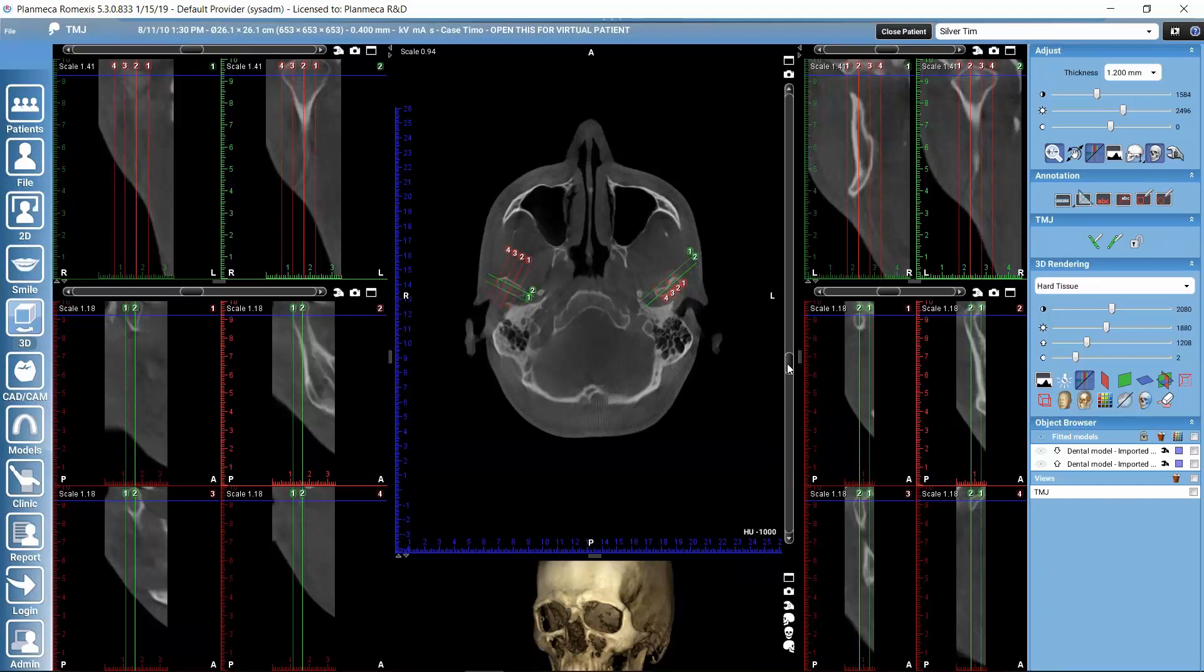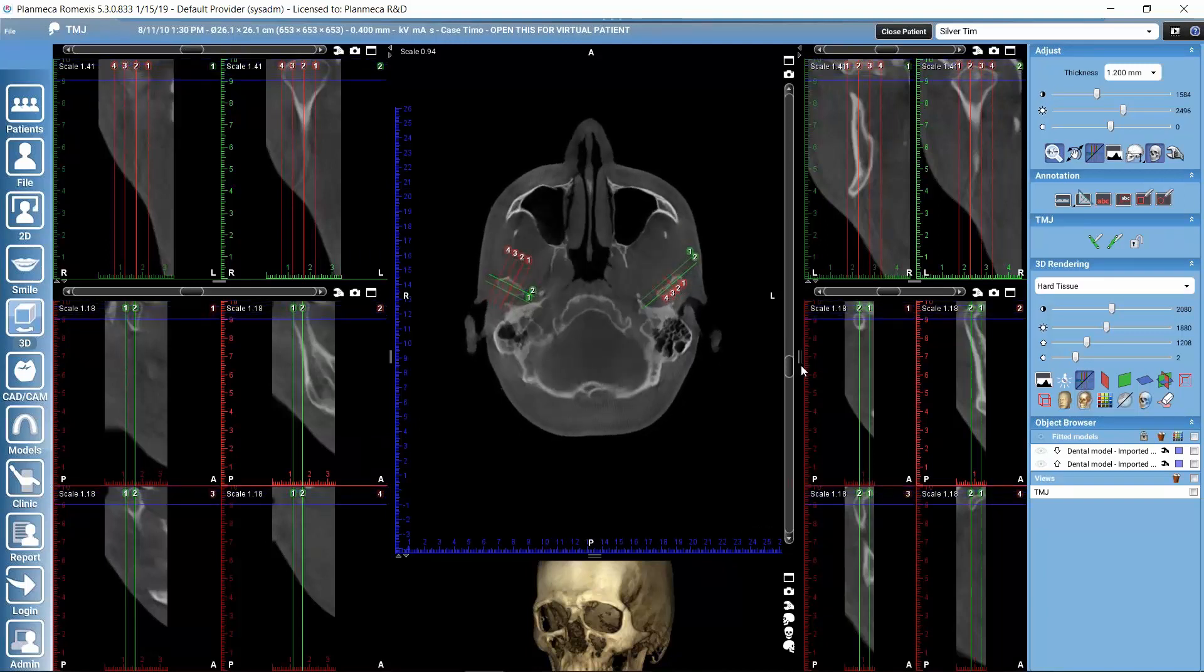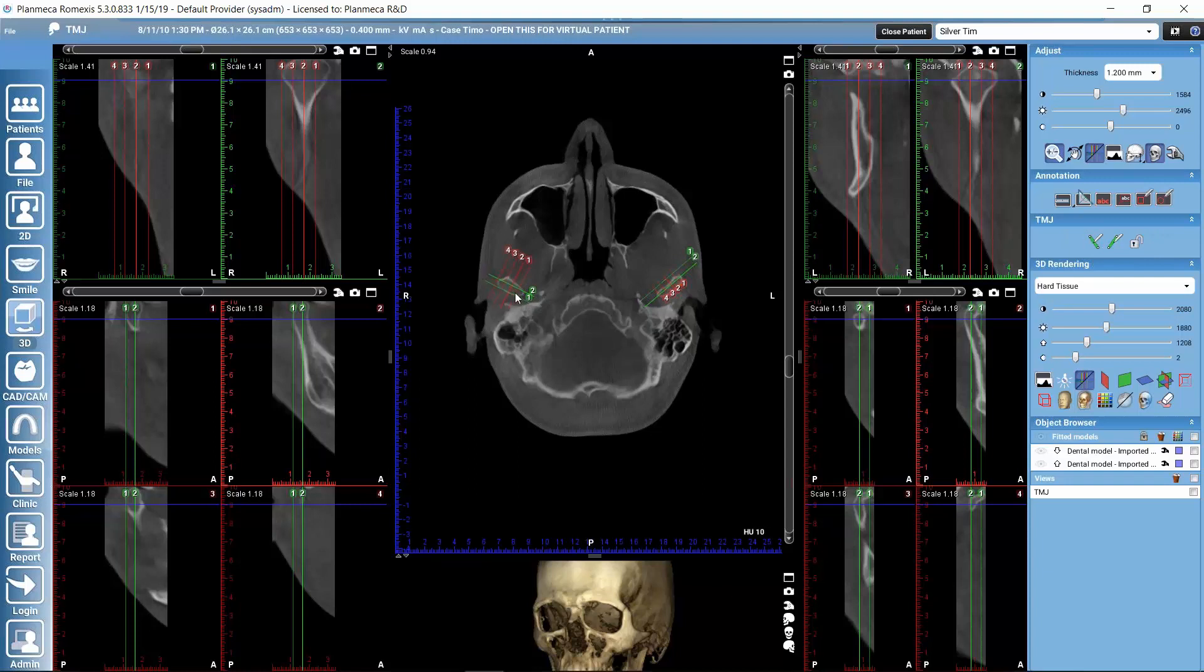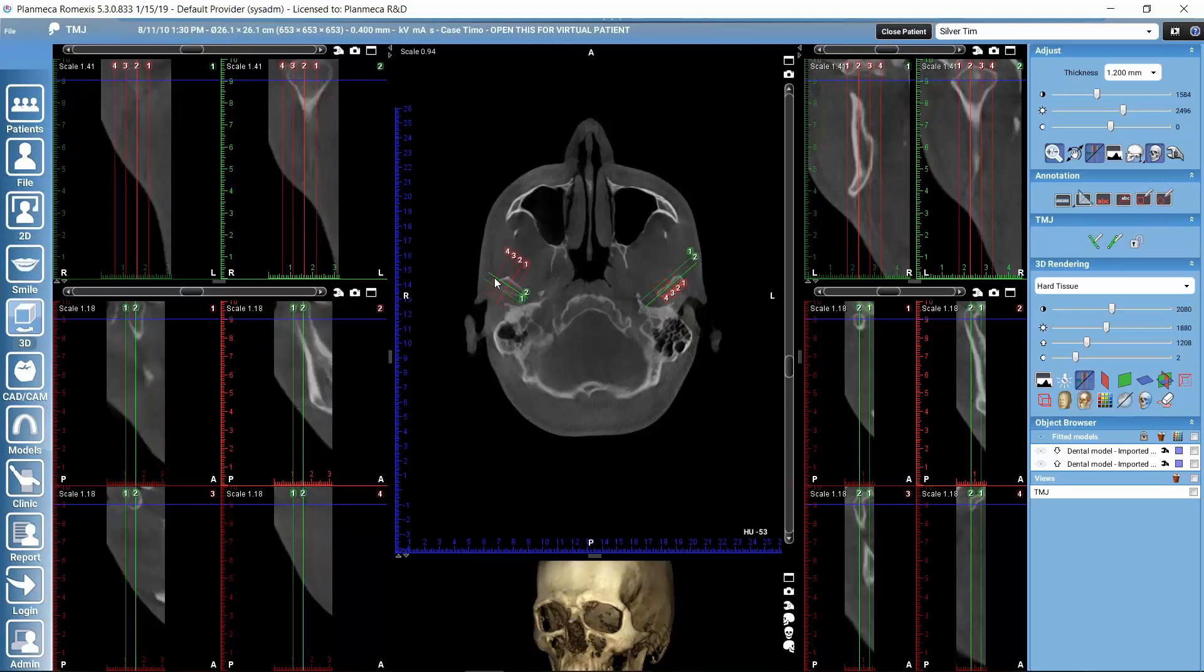When we start redoing these slices, let's use this axial view here and let's browse it until we can see the condyles of the patient. Then we can use these tools here to define these lines based on which the slice views are generated. If I click here on draw right posterior anterior line, I can click here with my left mouse button and drag until I get the direction and the length that I initially want to give for my slice views. Then I can release my mouse and now I got these two lines or two slices in this direction and then the four ones here perpendicular to that.